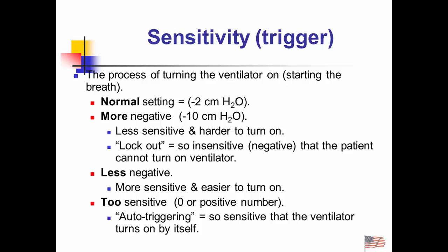I can make it so insensitive that I actually can lock the patient out. I don't care how much you draw back, you ain't turning this machine on. Well, that's just cruel and unusual punishment, but theoretically you can end up doing it. On the other end, I can make it so sensitive that it triggers by itself. We call that auto-triggering. That's not a desired effect. We want to be just sensitive enough that it requires a little bit of effort on the part of the patient, but it's not so sensitive that it turns itself on.